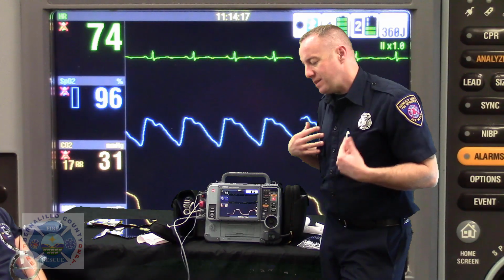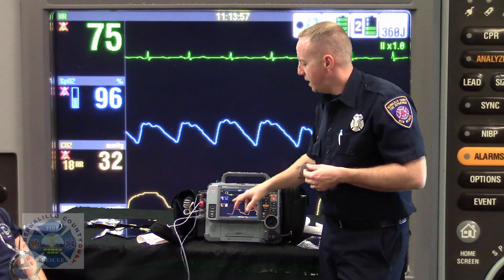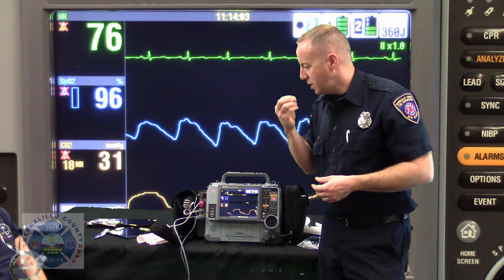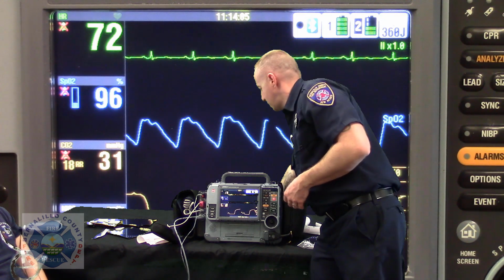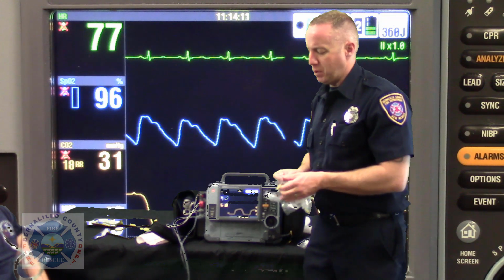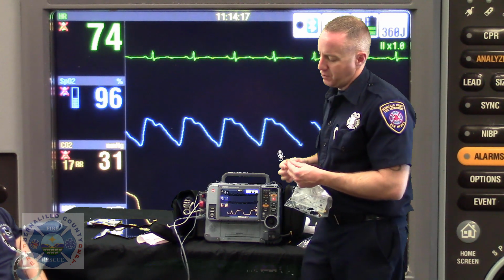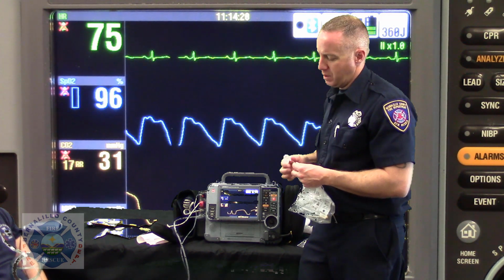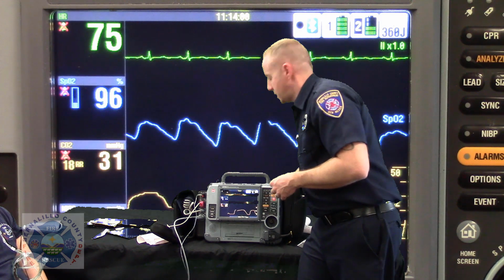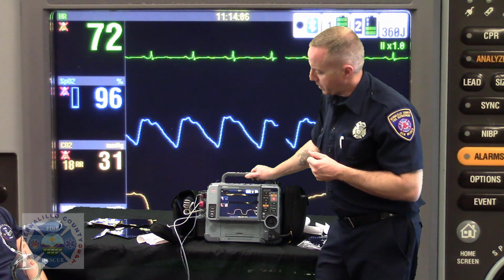CPAP, for instance. I suggest that you use the end tidal sampling cannula and do the CPAP over that, because the way this gives you a value is the closer you can get the sample to the patient's airway, the better. If you were to, for instance, try to do a side stream sample off of your CPAP really far away from the patient's exhalation, it's not going to be as accurate for you. It'll work, but it's not going to be optimal. If you want to really optimize what you're seeing on a patient, you really need the sample to be as close to the lungs as you can get it. So now we're going to see if our clinical picture is improving.